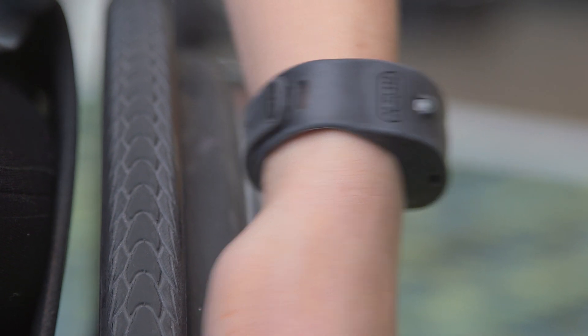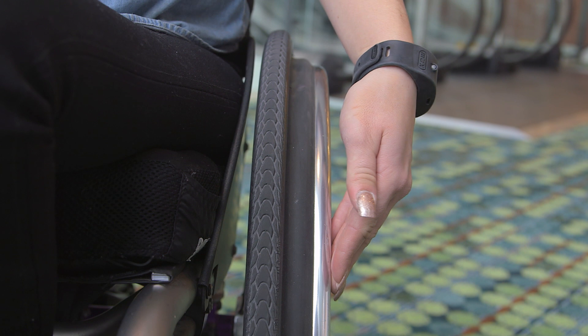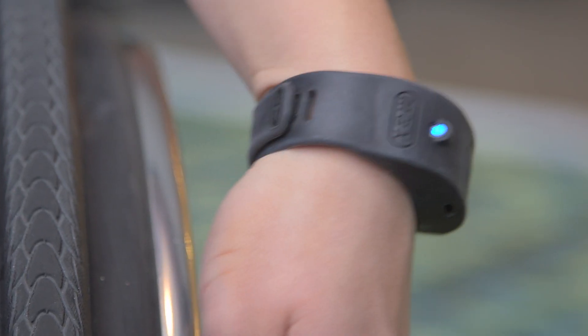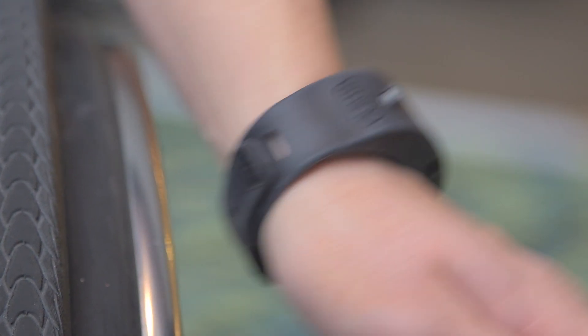Notice the light turns red when a tap is successful. Here's an example of an unsuccessful tap — notice that the wrist isn't really moving much. So make sure that the wristband moves to get a successful tap.